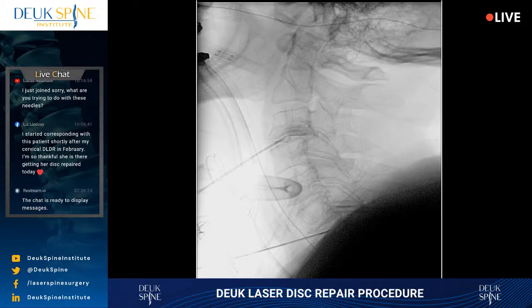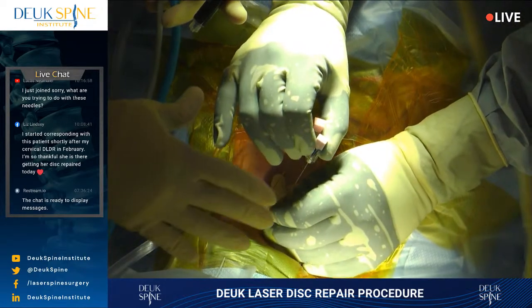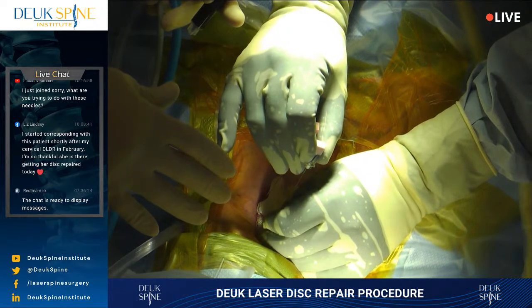That will give us a little bit of the blue dye that we love so much to stain the nuclear material that's degenerated with blue, because it's acidic, and degenerated nuclear material is acidic. And so, of course, acidic disc material is degenerated disc material. Shot.